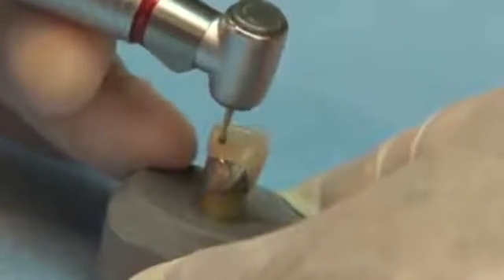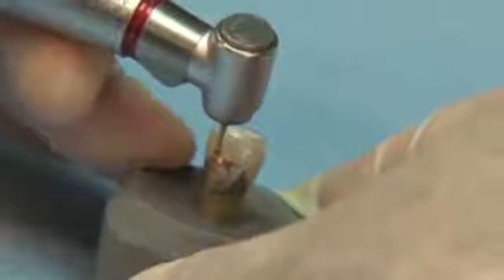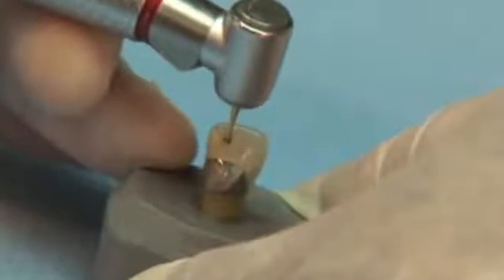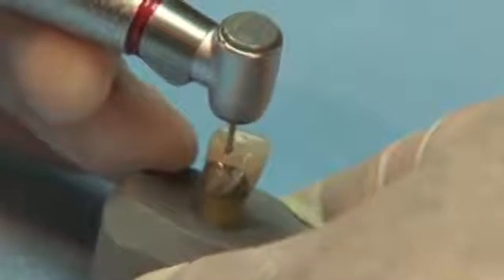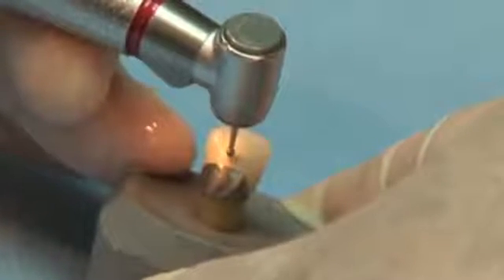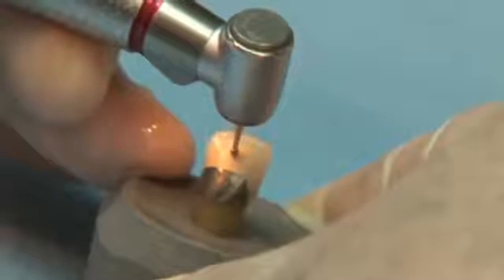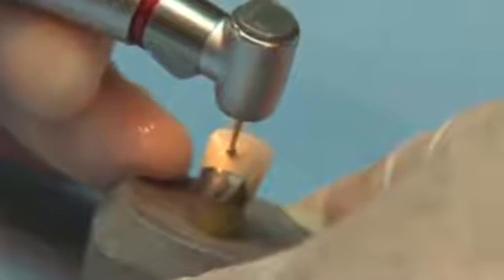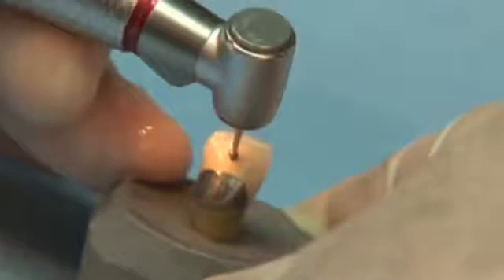Creating proper access for endodontic treatment requires the use of a burr that has the ability to cut through porcelain, composite, and metal. The Great White Series Carbide Burr is designed to cut through porcelain fused to metal crowns without shattering the porcelain or breaking the burr.